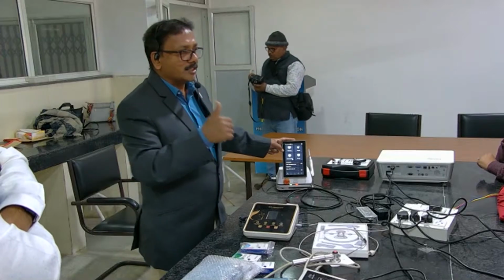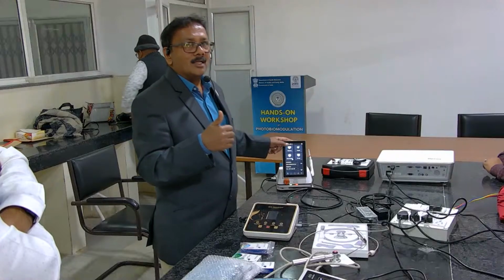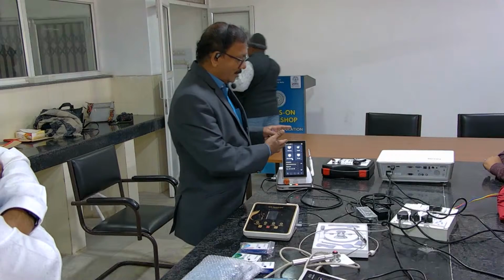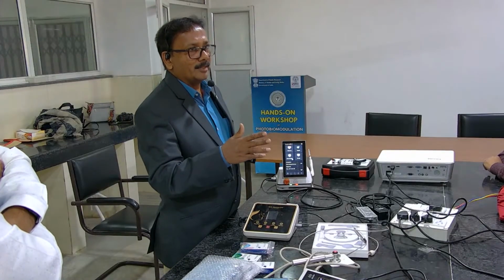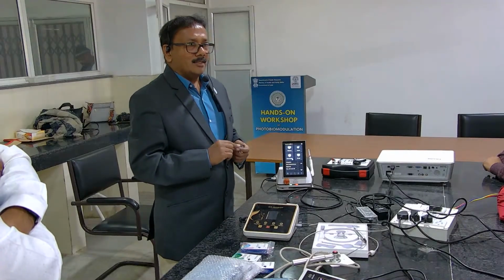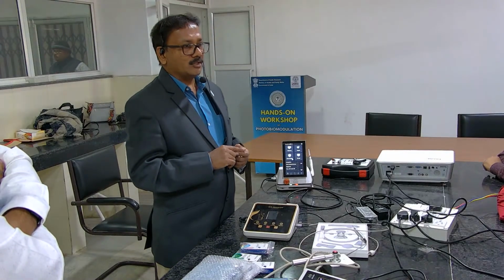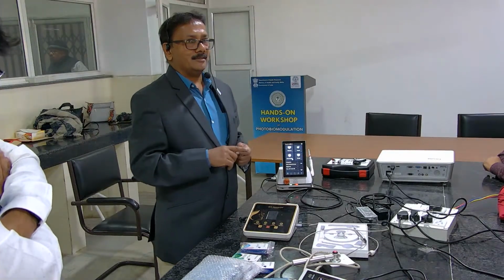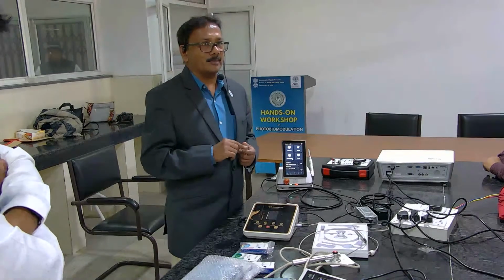surface, or if you don't need much depth of penetration, then 660 nanometer, 640 to 660 nanometer is the laser you want to go for. Oral medicine people, most of the time oral medicine staff or students, if they are not cutting the tissues, 660 nanometer will be enough for them. If you want a little deeper depth of penetration, and if you want cutting also, so if you want one laser which does all three jobs, you can go for 810 nanometers. 810 nanometers is the drug of choice for PBM, PDT, as well as cutting the tissues. That is PTT, photothermal therapy.